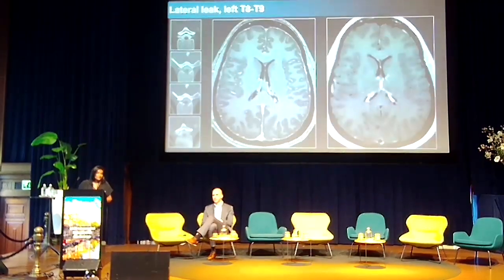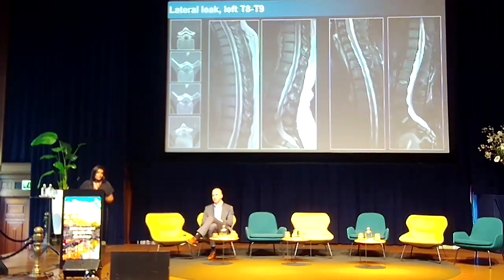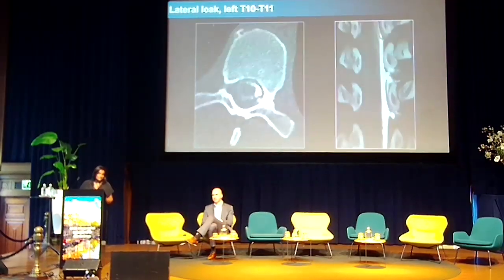And you can see in this patient, the brain MRI findings, that dural thickening resolves, and their brain sag, you can see the very marked tonsillar descent before, the pituitary distension, you can see that that has resolved. But most importantly, has the fluid gone? Yes, the fluid's gone. That's what's most important, image the spine.